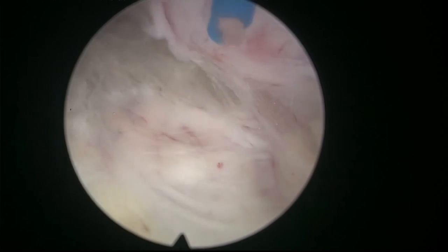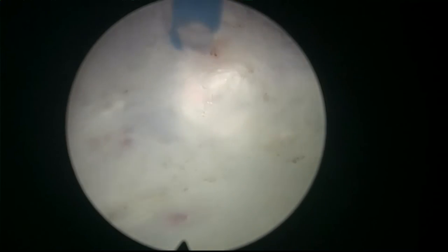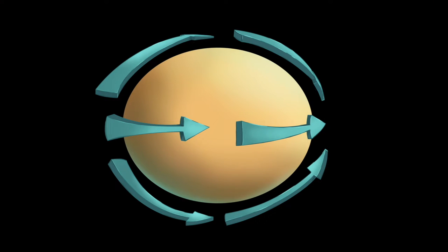That's the posterior plane — the separation between capsule and adenoma. I position the fiber at 12 o'clock as I always do. I like to keep it static at 12 o'clock and not rotate the camera, because rotating adds complexity whereas you can perfectly dissect the plane with the fiber at 12 o'clock. The screen is divided in two: anteriorly the adenoma, posteriorly the capsule, and in the middle the line of attack. The fiber protrudes about one-third of the diameter of the scope.